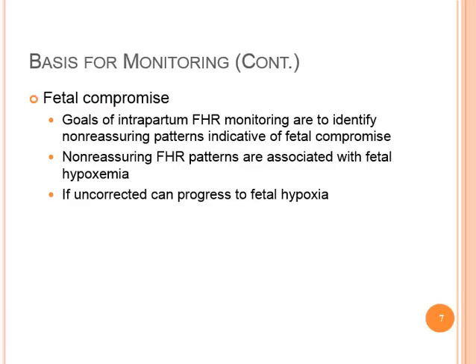Fetal compromise. The goals of intrapartum fetal heart rate monitoring are to identify and differentiate the normal or reassuring patterns from the abnormal or non-reassuring patterns, which can indicate fetal compromise. The non-reassuring fetal heart rate patterns are associated with fetal hypoxemia. If uncorrected, this can progress to fetal hypoxia.